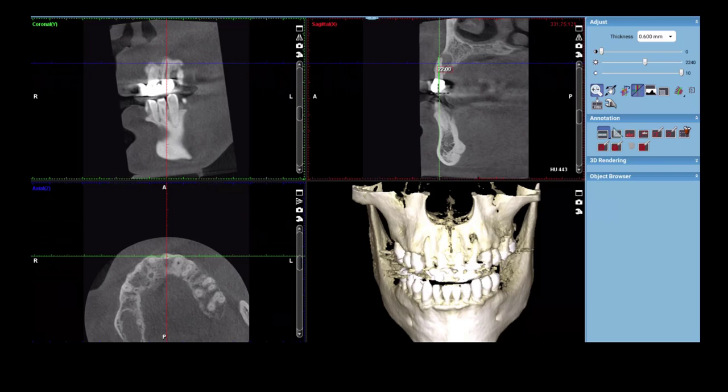So it's right at 22. In this case, we actually started the root canal treatment today. It was right at 21, 22 millimeters. What that does is help us select the files that we're going to use for treatment, and have an idea of where we are as we're working our way down the canal.